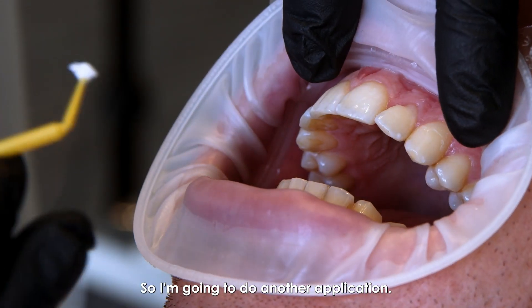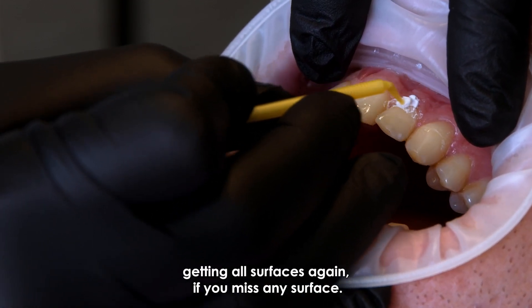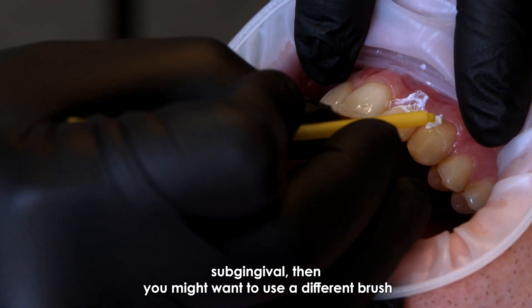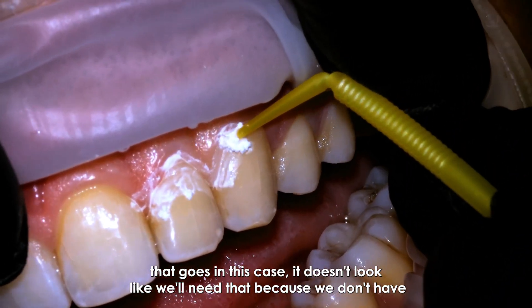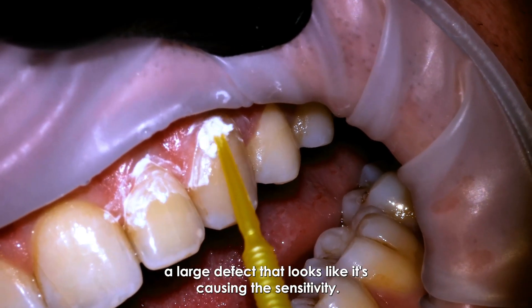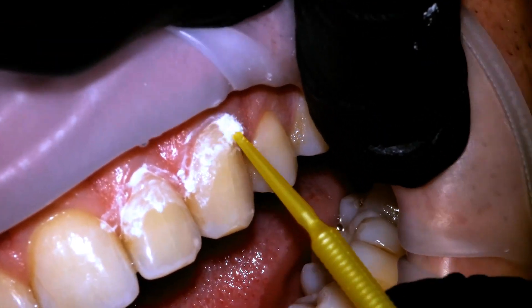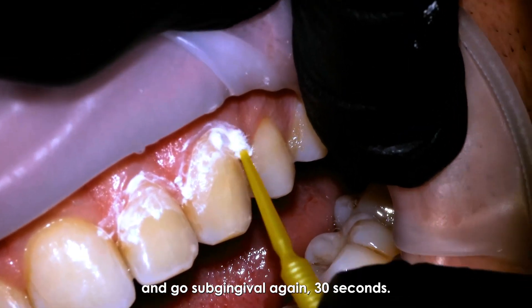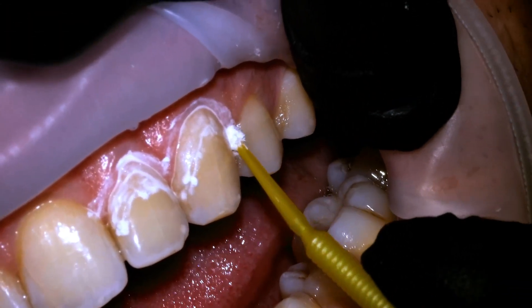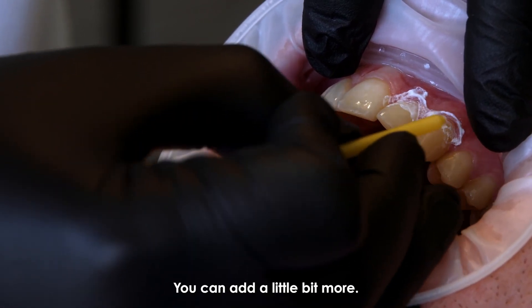Same exact technique again, making sure you're getting all surfaces. If you have to go a little bit subgingival, you might want to use a different brush. In this case it doesn't look like we'll need that, as there's no large defect — it's probably just the cervical area. But if I have any trouble, I'll take a probe or a brush and go subgingival. Again, 30 seconds. You can't really overdo it, but you can definitely underdo it. You can add a little bit more.